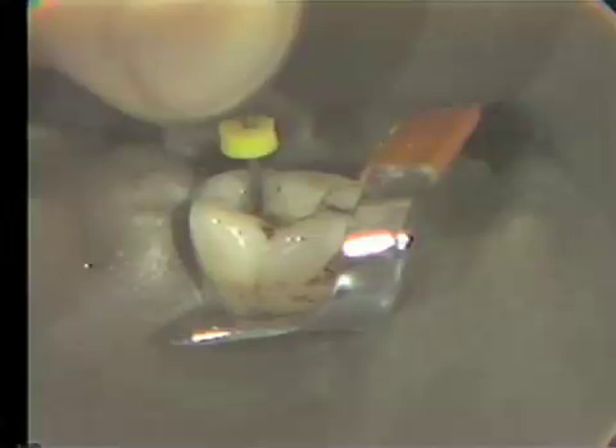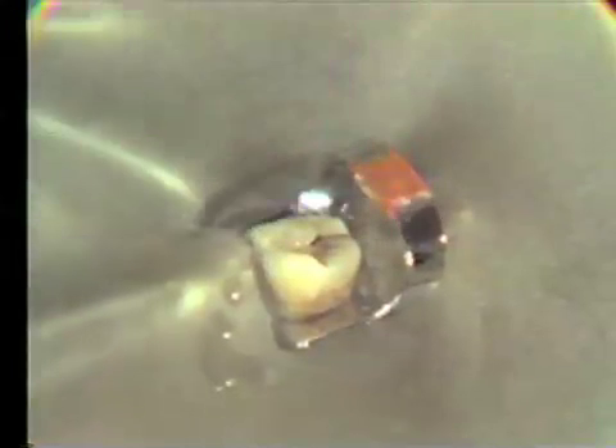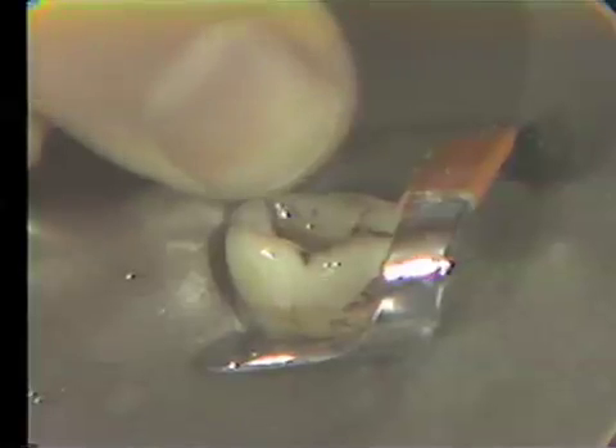Now I want to show you a radiograph and show you what this will look like. That's with the 25 file in place, and I've straightened out the canal now with just that little bit of filing. I've formed a ledge — I'm no longer making that curve — and now I'm in big trouble. Coming back to the tooth, if I take this one out and go back to the 20 file, I find that now this one won't go all the way to the proper place. I've ledged it, and now I've lost my length. And it's easy to do.